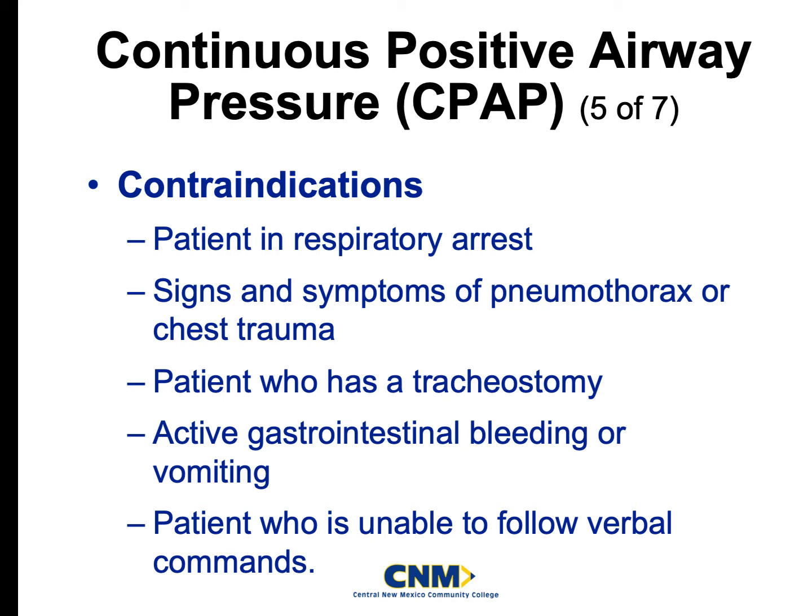And then patients who are unable to follow verbal commands, right? They have to be somewhat awake. They have to be able to follow some simple commands in order for you to set them up and explain to them the process, and then coach them on how to breathe with this in order for them to be able to oxygenate appropriately, in order for you to see the actual benefits of the machine.